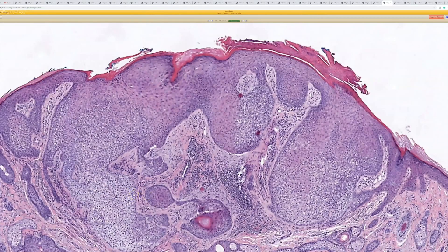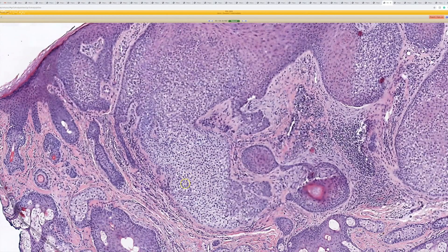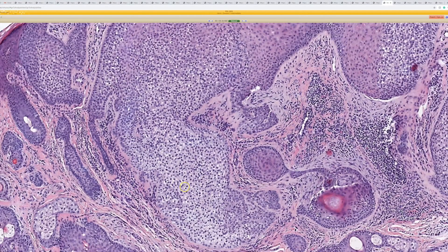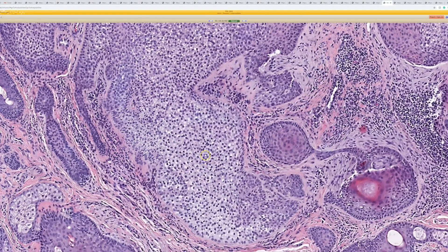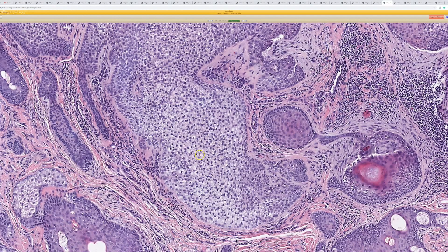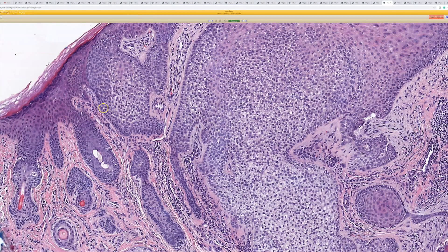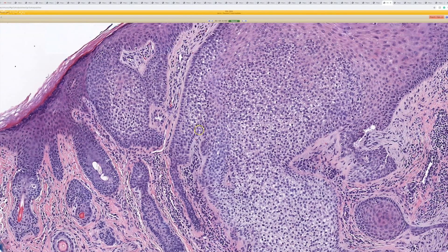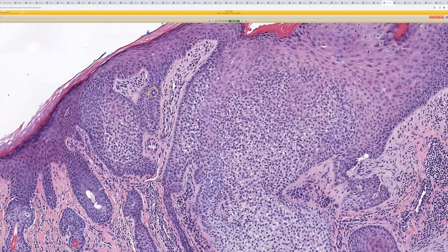What you want to find ideally is clear or pale cell change. This is a really good example — sometimes it is not so obvious. This represents outer root sheath differentiation. And you can see palisading of the basal keratinocytes, just like you'd see in the outer root sheath of a hair follicle.